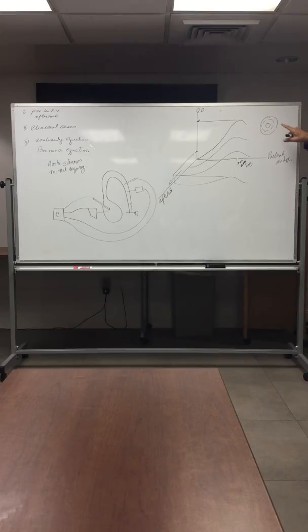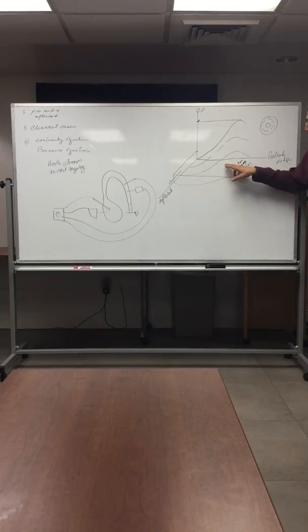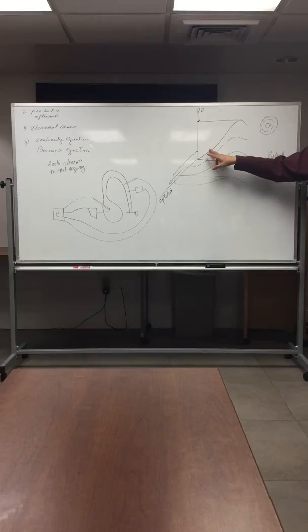Now, many of these patients come into the hospital, and you look at the chest x-ray, and it's clear. Somebody puts a Swan-Ganz catheter on the patient and measures a wedge of 25, and the first thing they do is hit him with diuretics, and the guy becomes hypotensive. They become hypotensive because they're depending on this curve to maintain the cardiac output, and they're essentially moving down the curve, decreasing the preload, and the cardiac output drops as you decrease the wedge on the heart, and the guy becomes hypotensive.